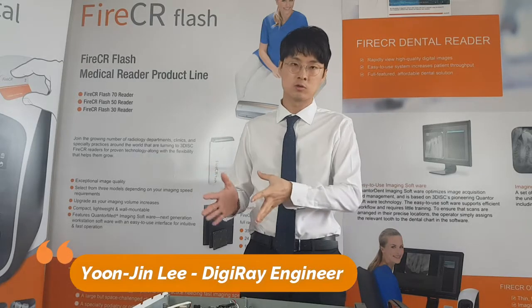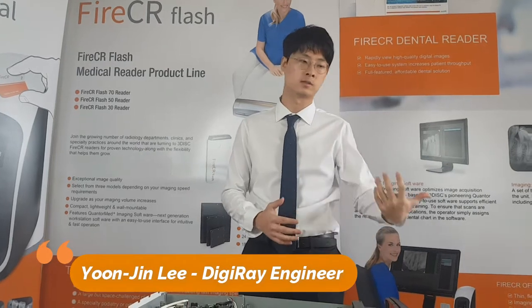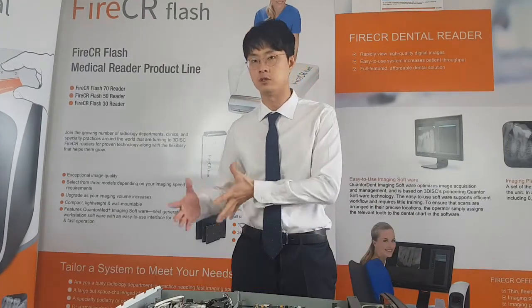Hi guys, please watch our previous videos on the disassembly of the covers before watching this video.